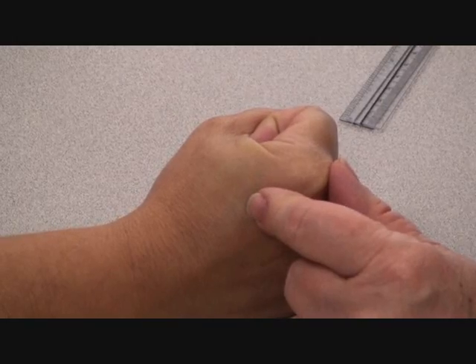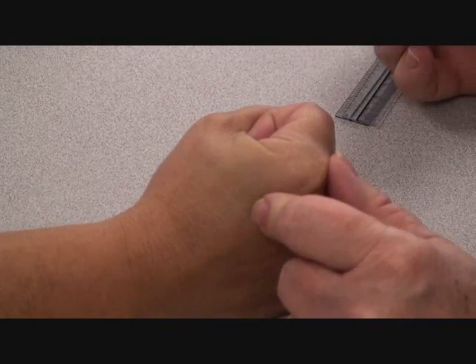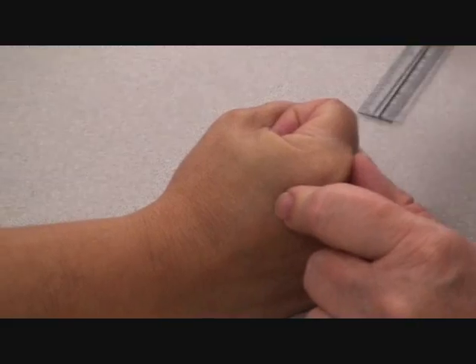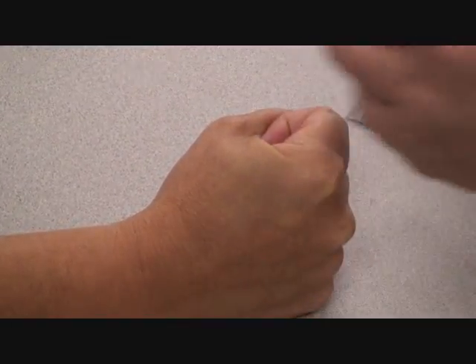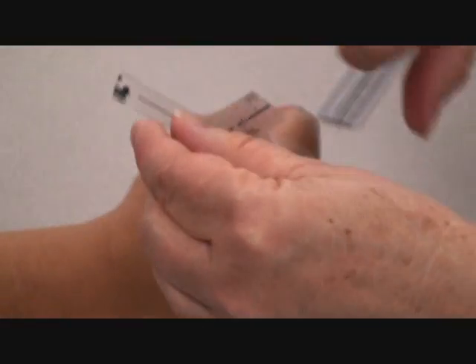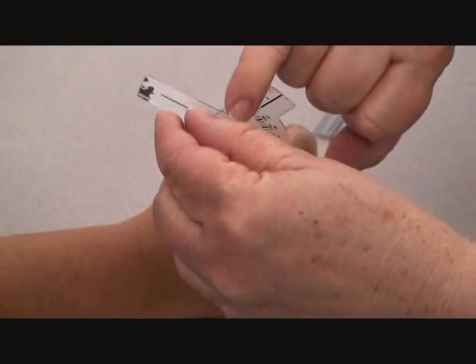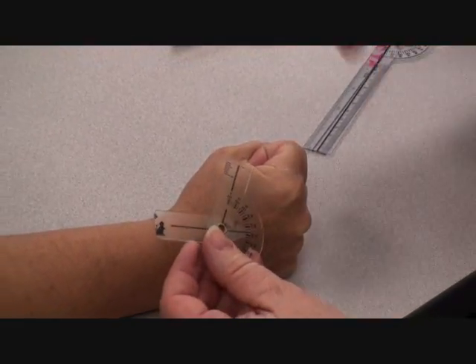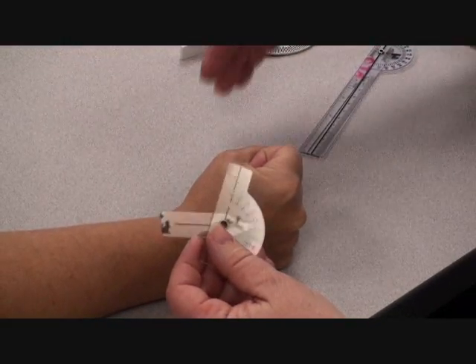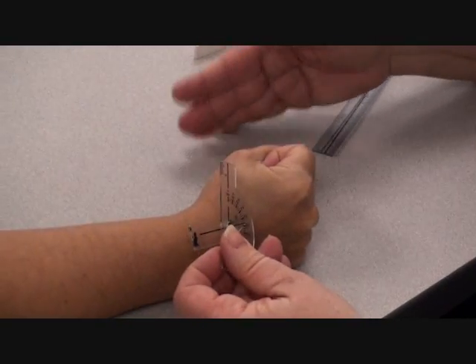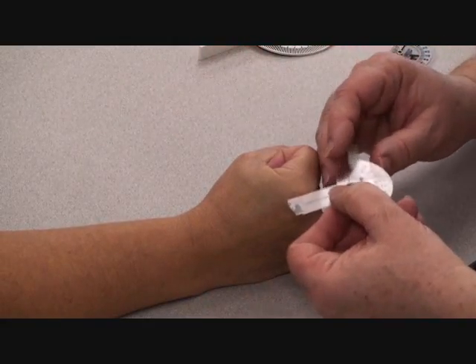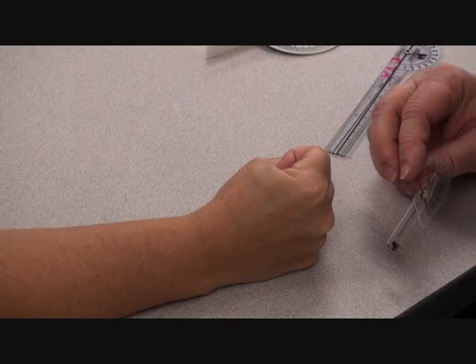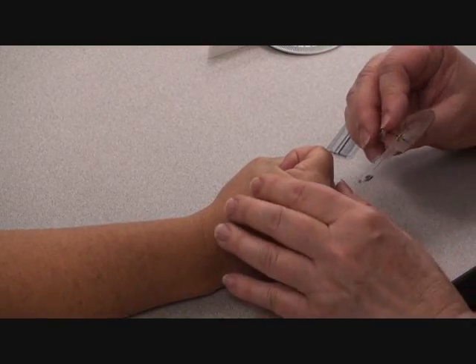And so sometimes people have just been using this to check themselves. They go over the top because that's super easy, right? And then they'll come off to the side or use the silhouette method of lining up the silhouette or the edge of the hand and finger with the black lines here. And they'll kind of use that as a check. They figure as long as they're getting about the same or say maybe five degrees less compared to measuring over the top, then they know that that's kind of their template of doing pretty good on that.